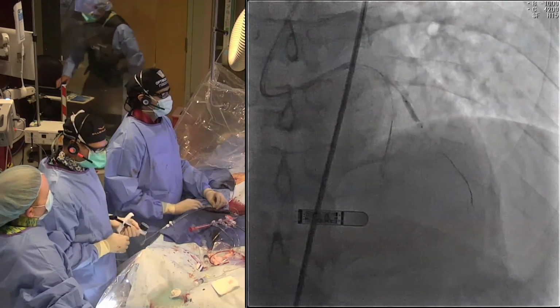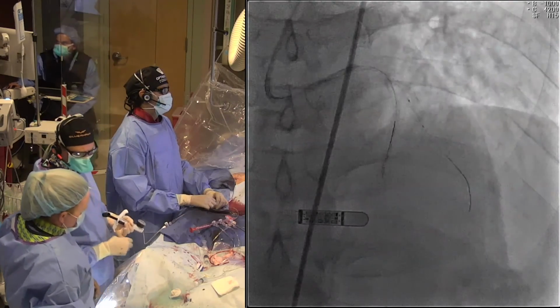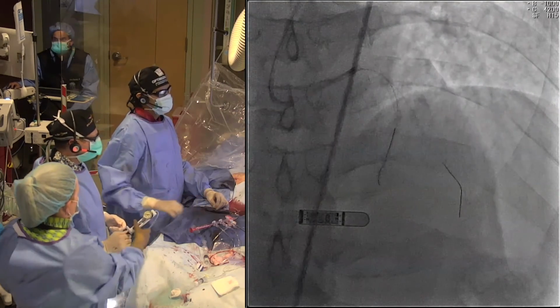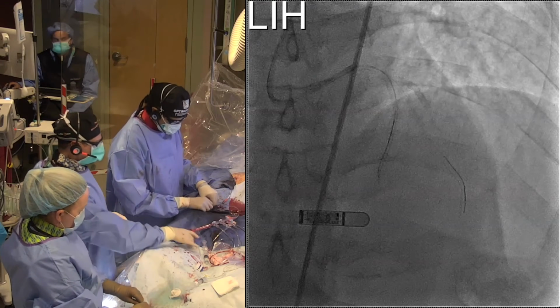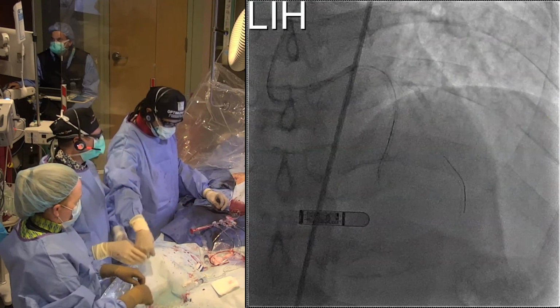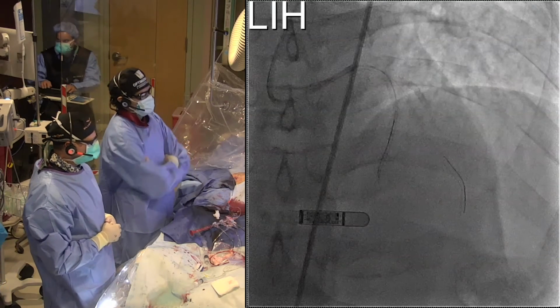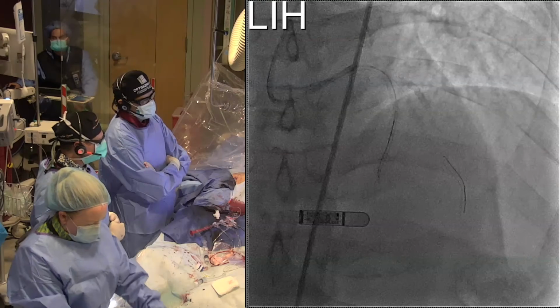And down. Do we have a 2.5 NC balloon, please? 14 for 14. Do we have a 2.5 NC or no? NC, please. Thank you. You see how it has that little bend in it? I'm worried that if we don't post-dilate it, it's going to end up getting an ISR there. That's the thing that is so difficult, honestly, to know angiographically, and where imaging really helps you. You have an inclination maybe the balloon or the stent wasn't fully expanded, and it's just hard to see on the angio unless you image.